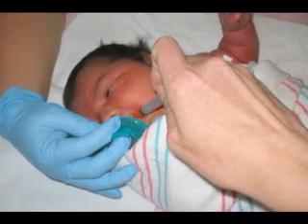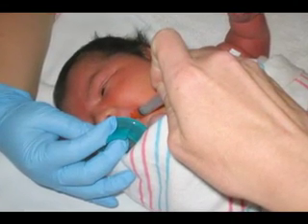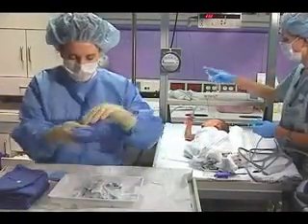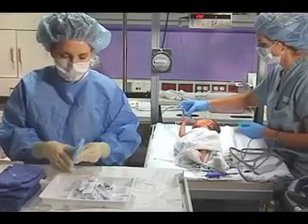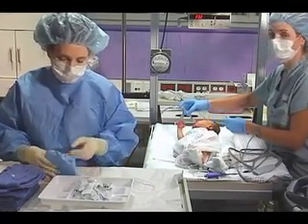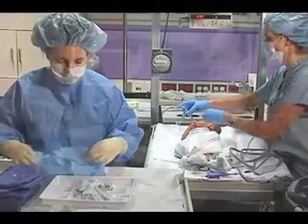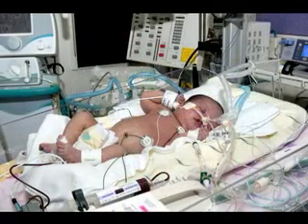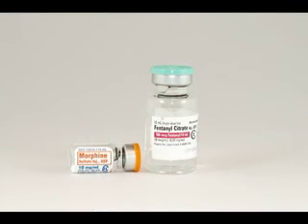Use both pharmacologic and non-pharmacologic methods of pain control when placing a neonatal PICC. Swaddling, caregiver support, and oral sucrose reduce pain but do not eliminate it. These methods should be used in combination with other analgesic agents for optimal pain control. Patients on continuous opioid infusions can still have pain and may require an additional opioid bolus to manage pain associated with the procedure.